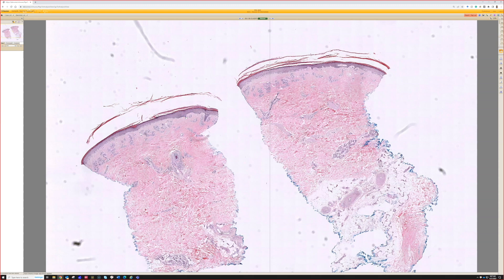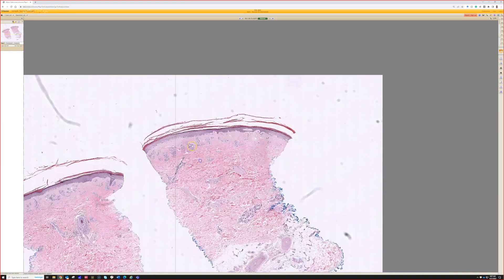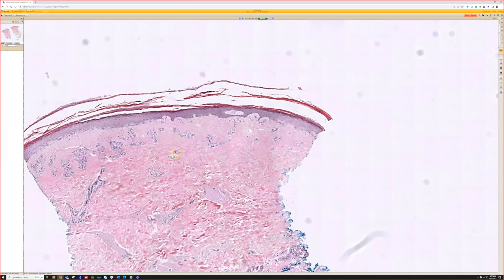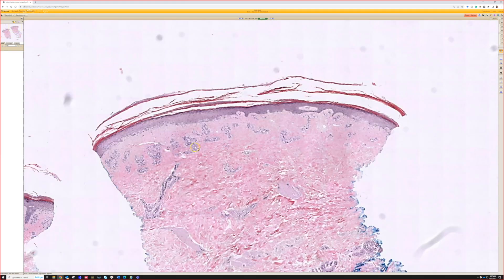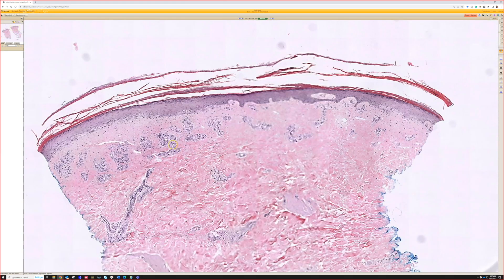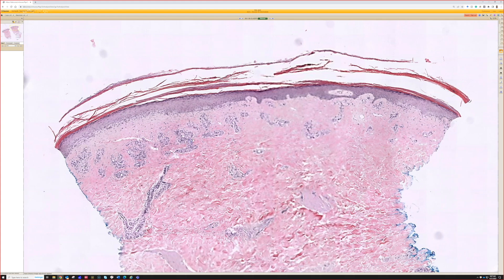We've got a punch biopsy here and the eye is drawn to the superficial dermis where we see little tufts or collections, lobules of something.